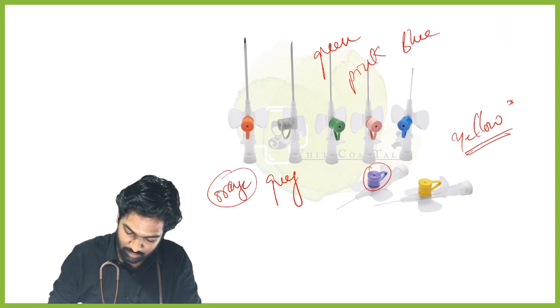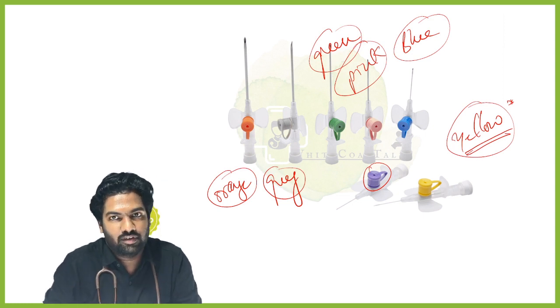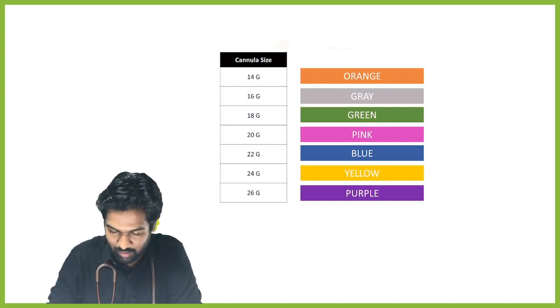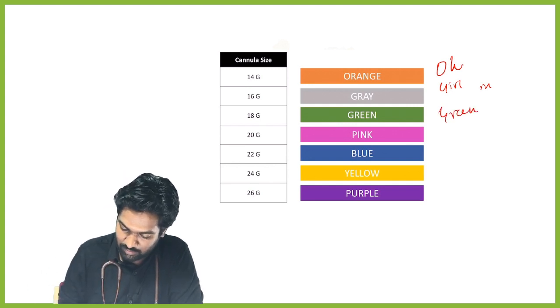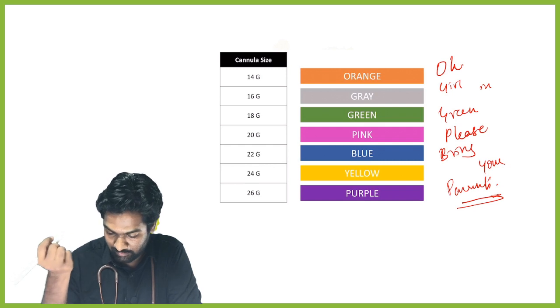Now, the question they have asked here is what gauges they are. What gauge of cannula is this? For that, try to remember one small mnemonic. Next slide is there. You can see orange, gray, green, pink, blue, and yellow. How do you have to remember this? I'll write it down. Oh girl in green, please bring your parents. Like if anybody is wearing a green top or shirt, oh girl in green, please bring your parents.